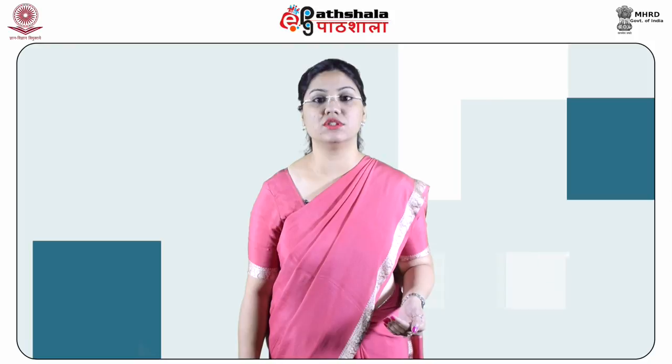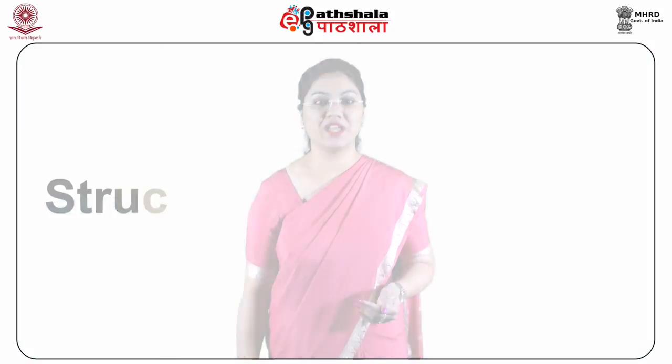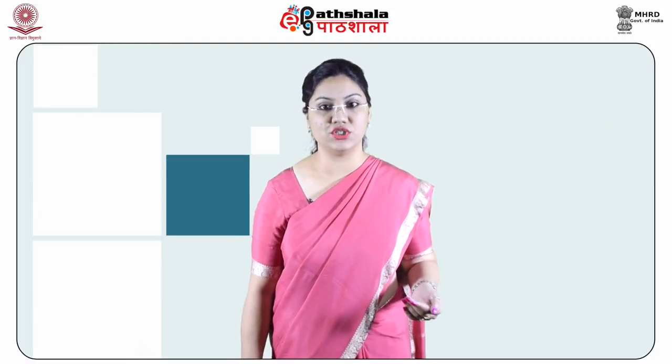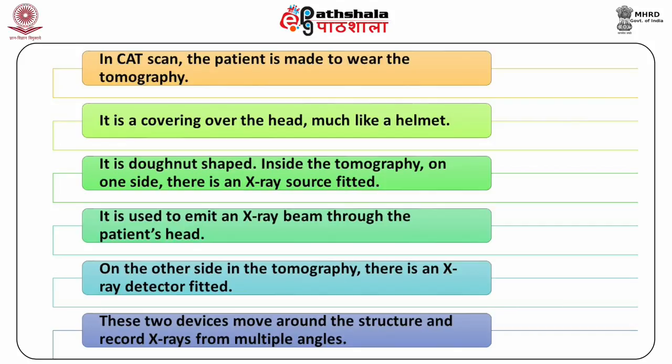The radiological imaging methods of investigation involve the following. Radiological methods comprise structural neuroimaging and functional neuroimaging. The choice of method depends upon the nature of the investigation as well as the suitability of the method with the condition of the patient. Structural neuroimaging. As the name suggests, structural neuroimaging generates images of the static structures of the brain. A few examples of the current technologies used for this are the computed axial tomography scan and magnetic resonance imaging.